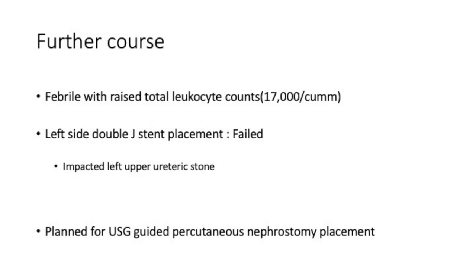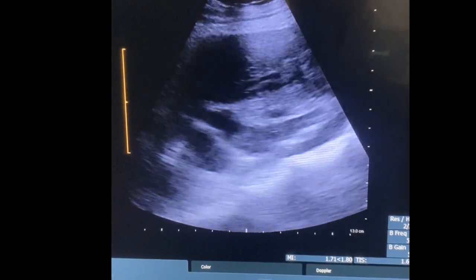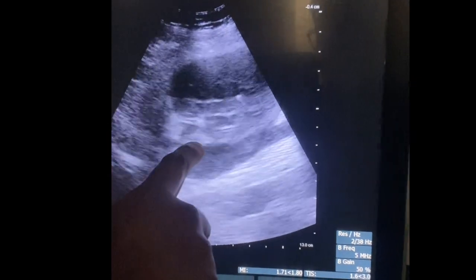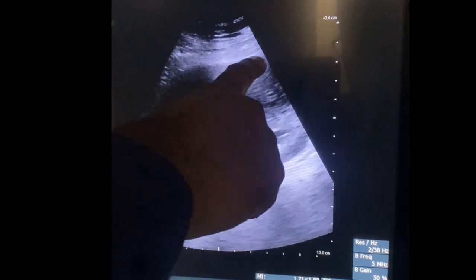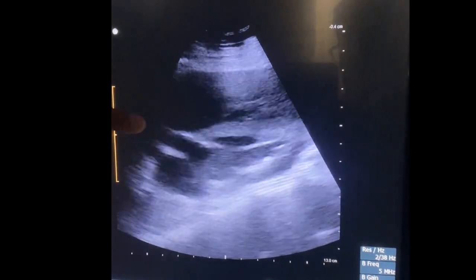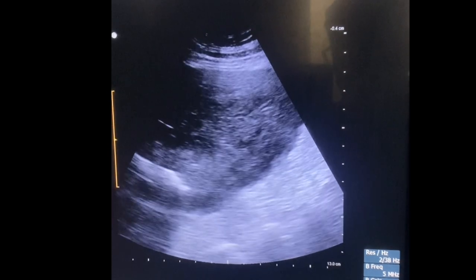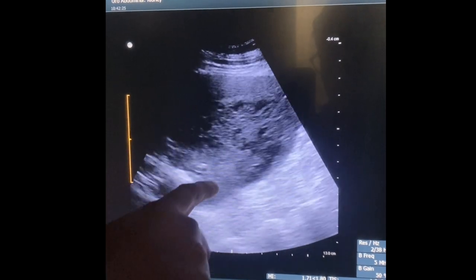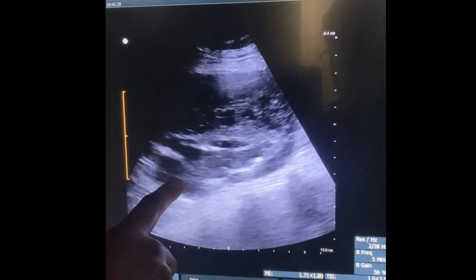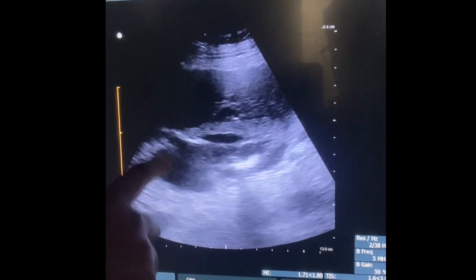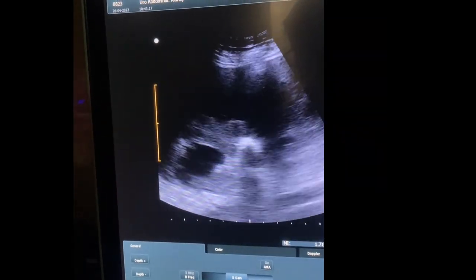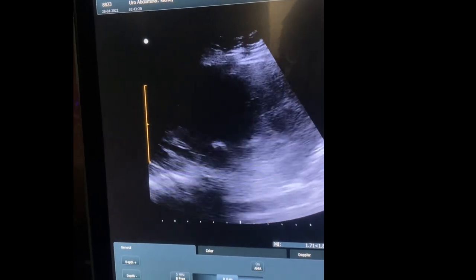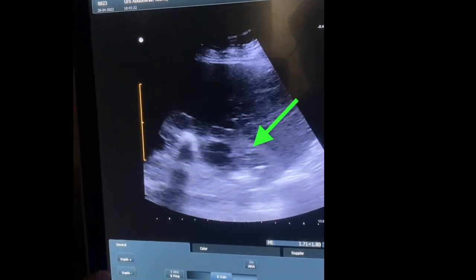The patient was placed in a prone position for ultrasound assessment of the left kidney. You can observe that there is a large perinephric hematoma seen posterior to the left kidney. It is significantly large in size and is actually compressing the left kidney, which is located deep to it. You can also see moderate hydronephrosis in the left kidney, with a few echogenic shadows suggestive of calculi.